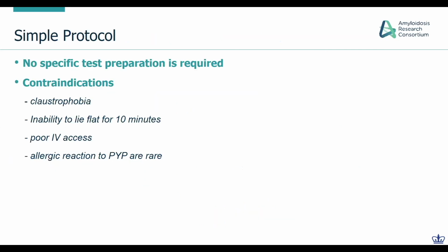And it's a pretty simple protocol. No specific test preparation is required, no dietary restriction. The patient doesn't even have to take off their clothes for the imaging. It's a pretty simple test.